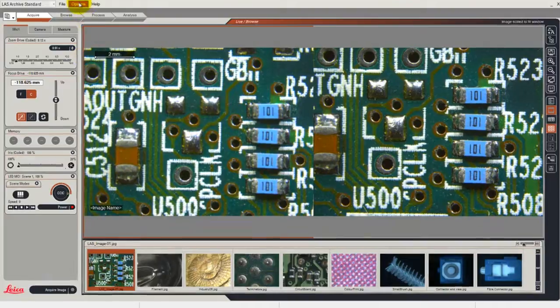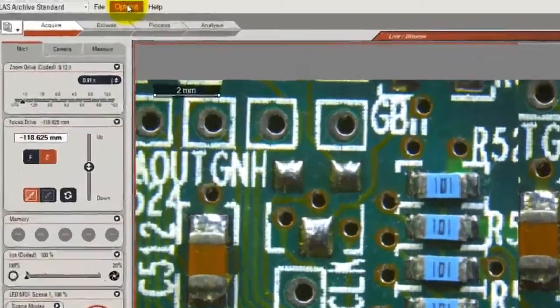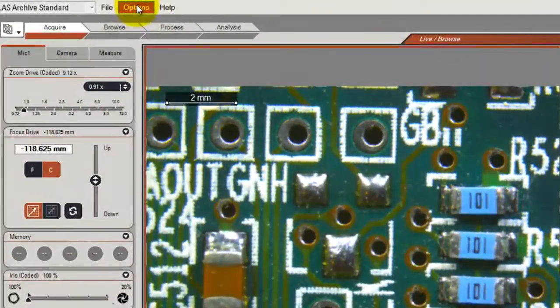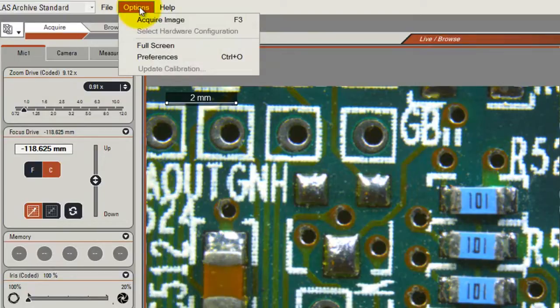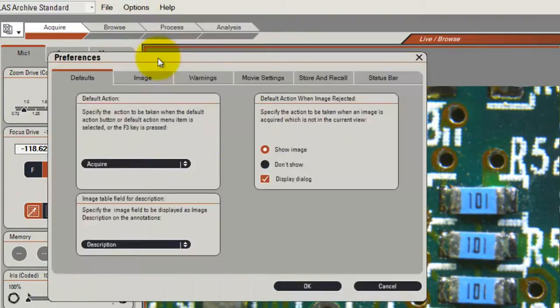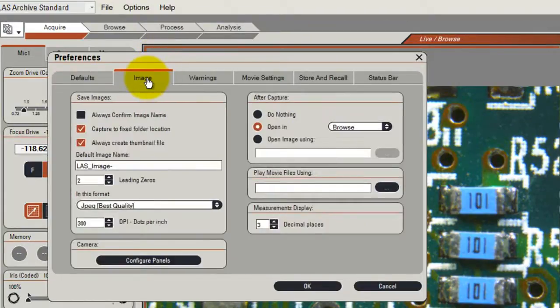Instead of acquiring the image into Browse, I don't want to switch to Browse. I change this by looking at the options and then selecting the preferences dialog. On the preferences dialog I select the image tab and then I look at the panel that is called after capture.